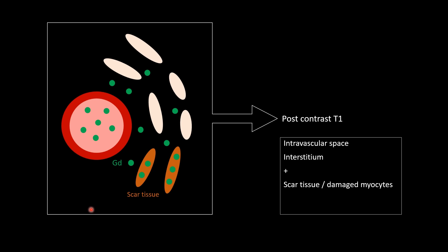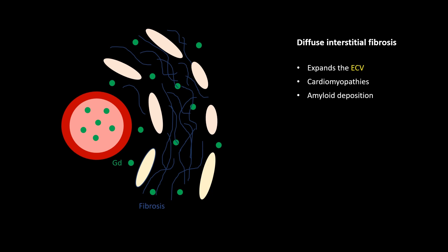This is a post-contrast T1 mapping image. Gadolinium gets deposited in the interstitium and in damaged cells, scar tissue, or fibrosis. So the signal for post-contrast T1 mapping comes from the interstitium and scar tissue. Diffuse interstitial fibrosis — as occurs in certain cardiomyopathies or amyloid deposition — causes expansion of the ECV, which we can detect on mapping.